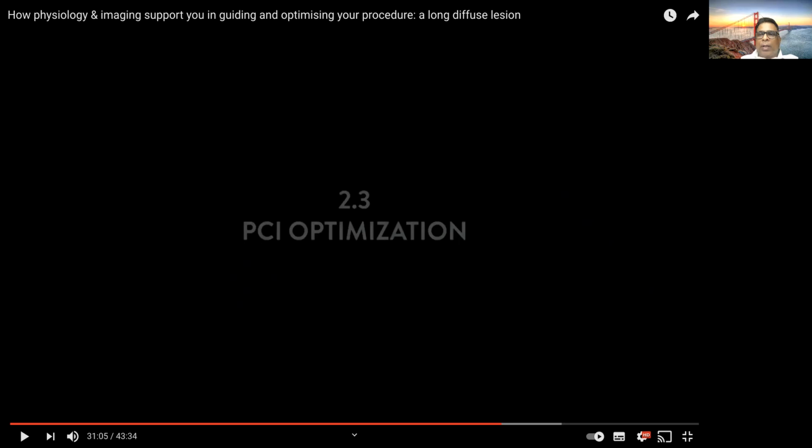Then they estimated the iFR, FFR, PPG index, etc., and there was a focal co-registration iFR value which was very significant. They used the Ultreon 1 software, and that demonstrated the calcification beautifully. They modified the calcium with rota and balloon, and they implanted a stent. We had MLD, now we're looking for MAX.